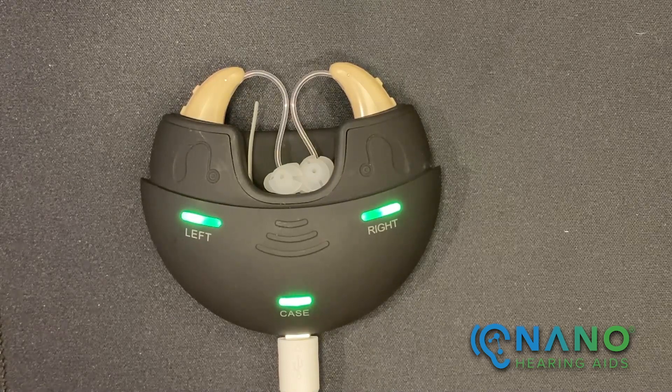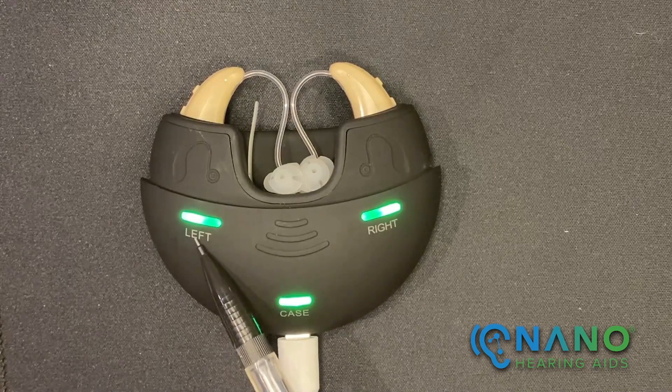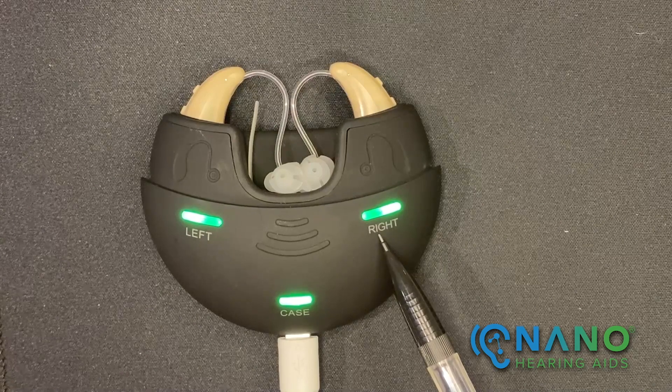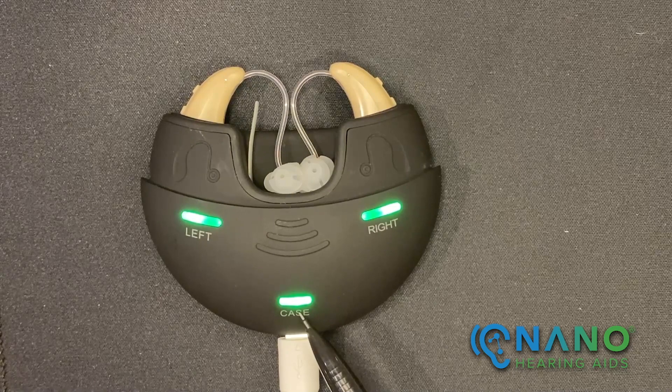The charging case has three light indicators. The indicator on the left is for the left hearing aid, the indicator on the right is for the right hearing aid, and the indicator in the center is for the case itself.